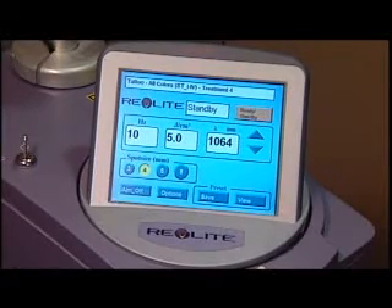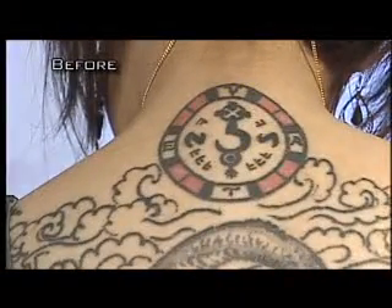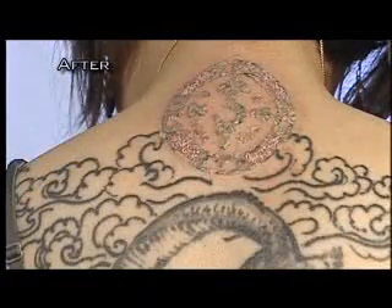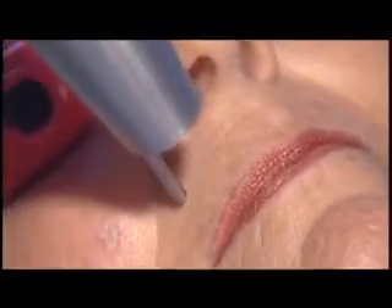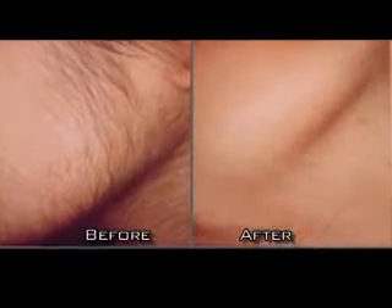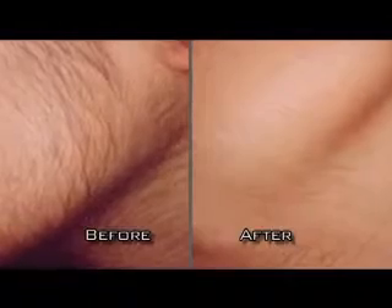The Revlite laser has allowed us to really diversify what we can do with this kind of laser. We can use it to treat brown spots — epidermal brown spots — Nevus of Ota, and a whole variety of tattoos in different colors. But even more than that, this is the ultimate non-ablative skin toning system because of the unique PTP pulse. And what people don't think about is that this is also the ideal system to treat fine vellus hairs — it removes them instantly, and most long pulse lasers just don't do a good job of that.